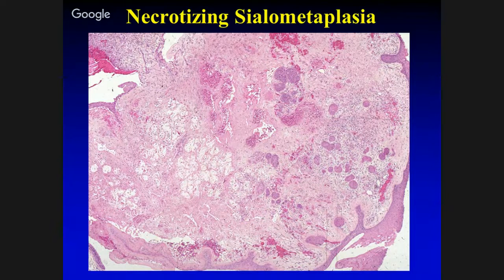And when you're doing a frozen and you jump to high magnification in a patient who's got a diagnosis of cancer, who received radiation, comes back 6 or 8 weeks later for a reevaluation, and there's a little bump there. And the surgeon says, you know what, either biopsy it or, because they're worried about cancer, a frozen. And we are tasked to identify whether there's persistent cancer, because at 6 to 8 weeks it's not going to be recurrent, or something else. So one of the something else is this, necrotizing sialometaplasia or just sialometaplasia without the necrotic lobules.